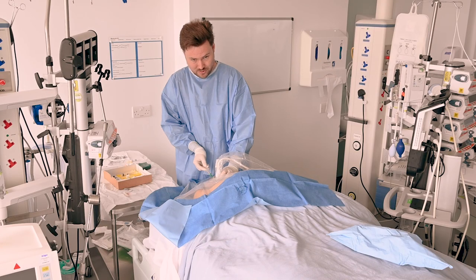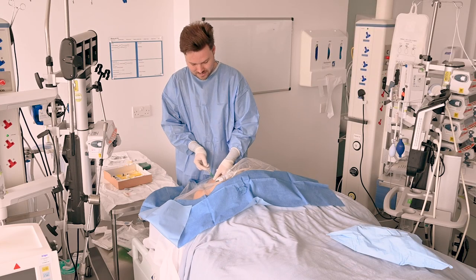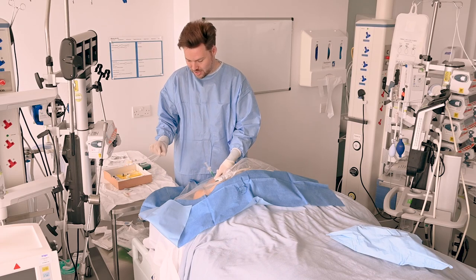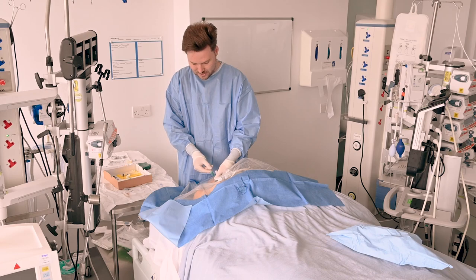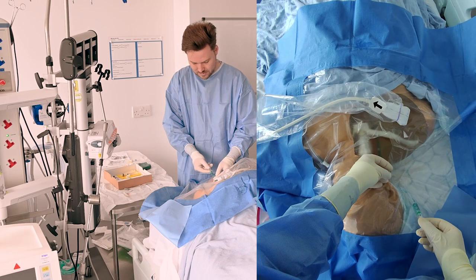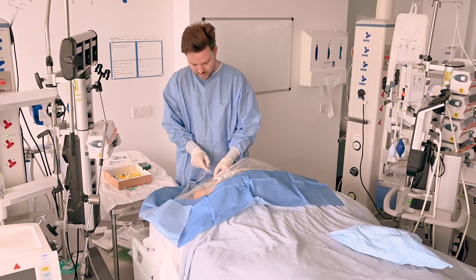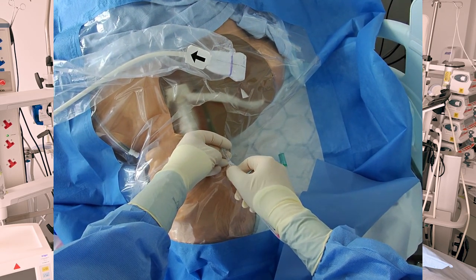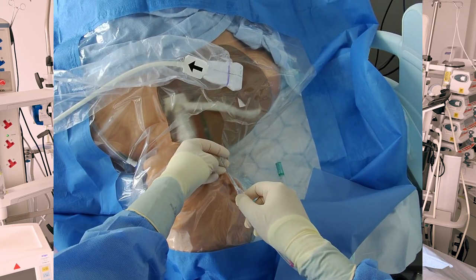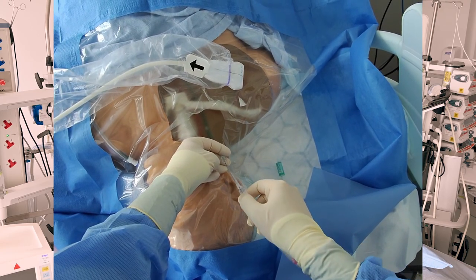Now I'm going to release the pressure on my ultrasound. Anchor again with that left hand and make sure that I can still aspirate venous blood. The next step is going to be inserting the guide wire. Making sure that I'm anchored, I'm going to release the syringe, cover over the open needle end, and then insert the guide wire. Once I've inserted a short amount, I'm then going to feed back, grasp and push forwards — feed back, grasp and push forwards — to give me an idea whether I'm actually in the vein or if I'm in the subcutaneous tissue.